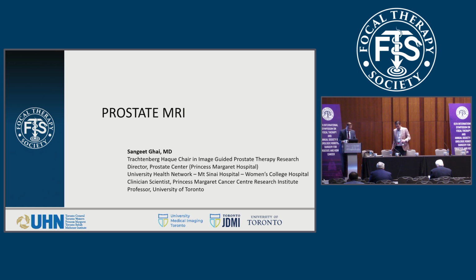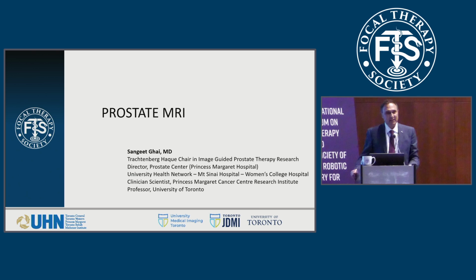Thank you, Art, for that introduction and your kind words. It's a pleasure to be here today. This session is more about prostate MR interpretation and just making it easier. I'm going to be giving an overview of prostate MRI, and I'll discuss the PI-RADS scoring for prostate MR. Then Art, in the second half of this session, is going to show some nice examples and talk perhaps about image quality as well.